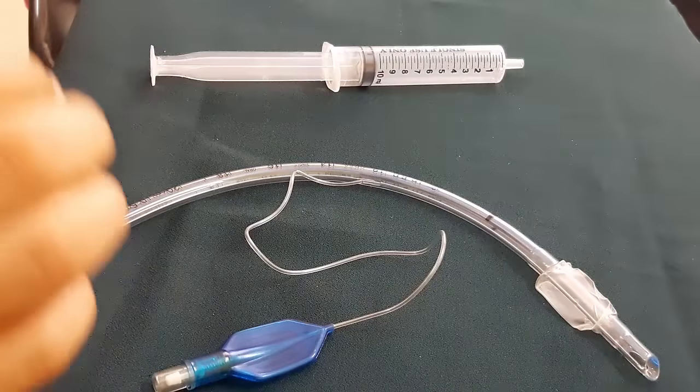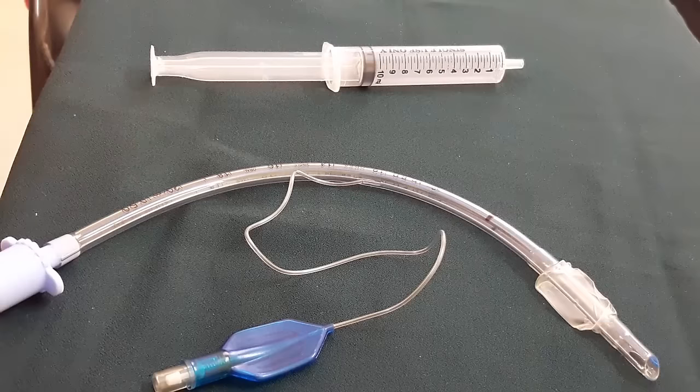The majority of cuffs used are low pressure high volume cuffs. Cuffed ET tubes are used in children greater than eight years of age, and uncuffed tubes are used in children less than eight years because they have a narrow subglottic area which itself functions as a natural cuff, preventing the ET tube from slipping.